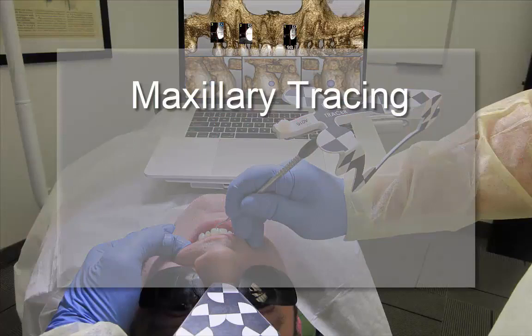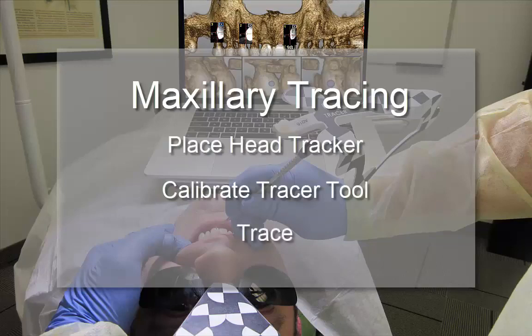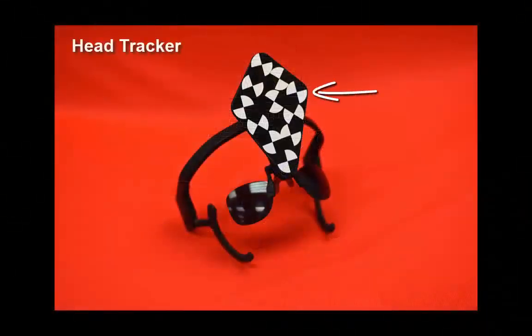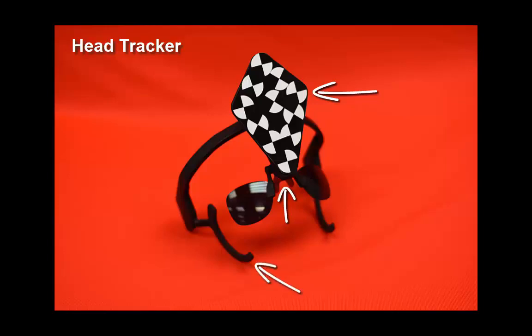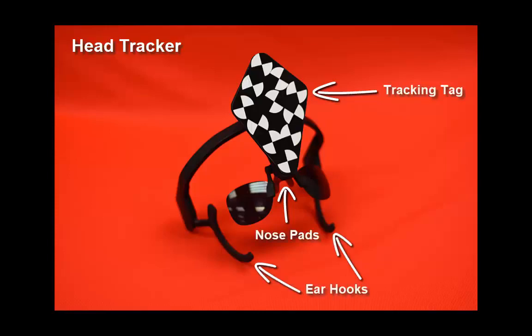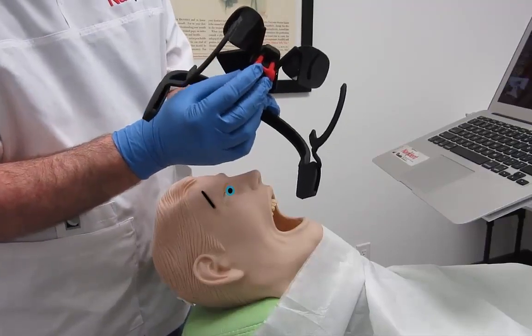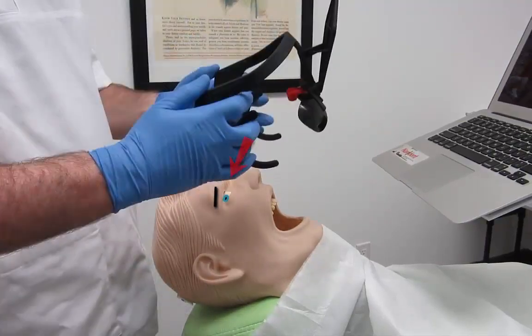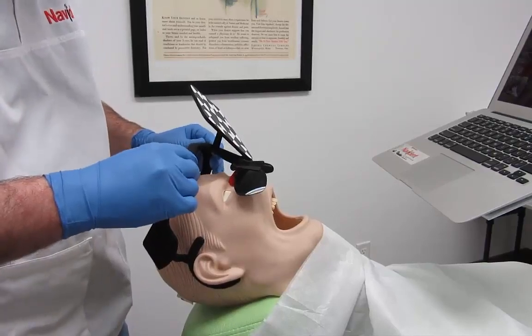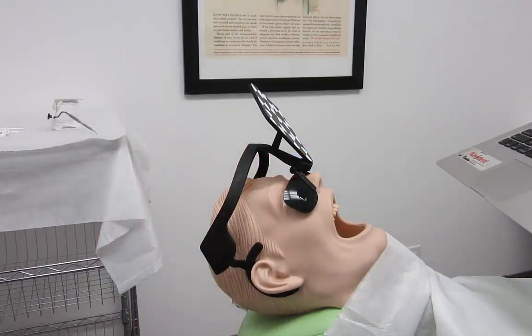The planning part is completed, and we move over to tracing — starting with installation of the head tracker, followed by calibration of the tracer tooltip, and then tracing on the teeth we have just marked. The head tracker is the device which allows us to track the patient's maxilla during navigation. It consists of a plastic frame with protective eye lenses holding a tracking tag, affixed to the patient's head using elastic ear hooks and supporting nose pads. The nose pads can be separated and adjusted — they should be positioned aside the most depressed point of the nose bridge, between the eyes where the skin barely moves when the nose is wrinkled. The ear hooks should be placed fully around each ear and in contact with the skull. Hair should be moved away, and some spacing should be left between the lenses and the skin to prevent accidental contact and motion of the tag if the patient winces.